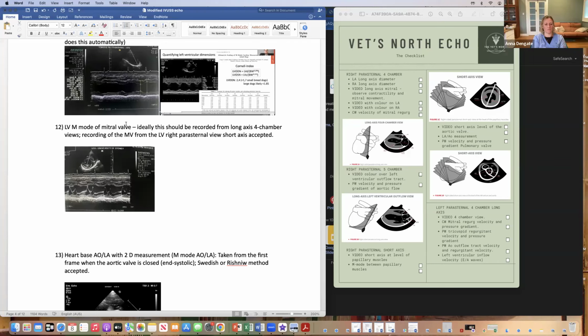Got it. Okay. And I think there's some cardiologists that like the short axis M modes, and there's some that seem to like the long axis ones. Oh no, they like the short axis, but for the EPSS, they actually recommended the long axis. I find that much more accurate because you can see the valve leaflet so nicely in long axis, whereas in this you're just catching, you're not sure at what point you're catching it, you're not sure where your line is, kind of thing.